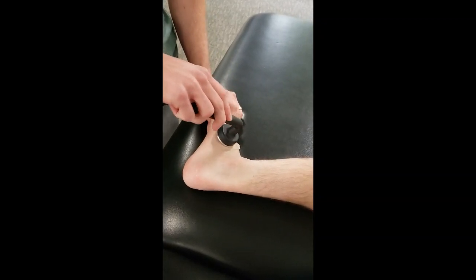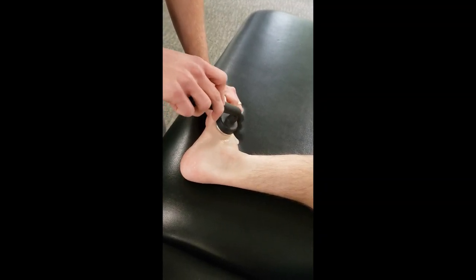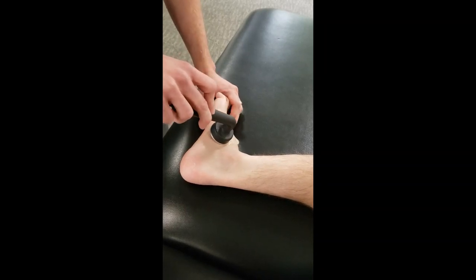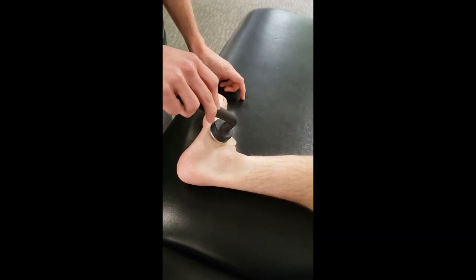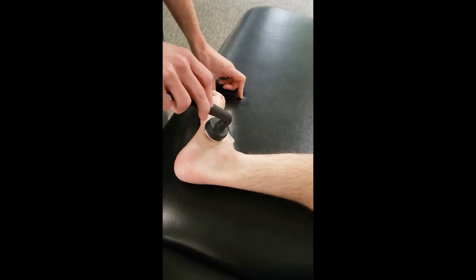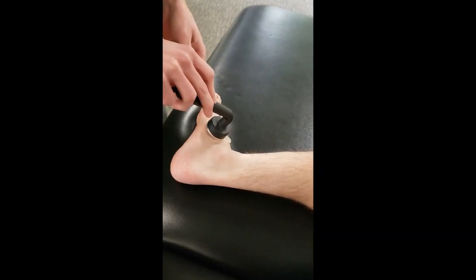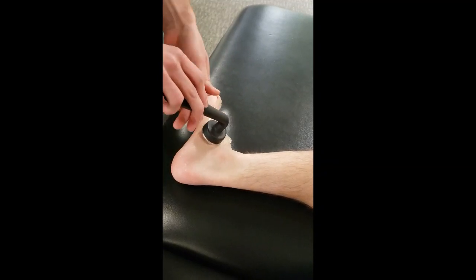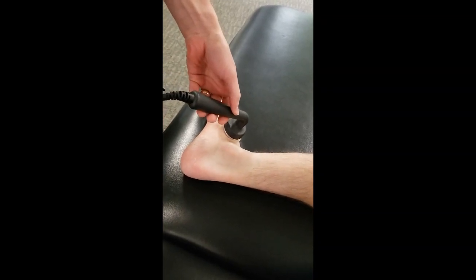So the head of this instrument is not typically the whole effective radiating area. We're going to want to do about 2 to 3 times the size of that determined by the instrument. So you'd have to determine what that is, and you would do 2 to 3 times that size around this injured area. Okay, so I'll just do that for about 8 minutes for the patient, and then I'll go ahead and come over here and turn that off while it has contact.